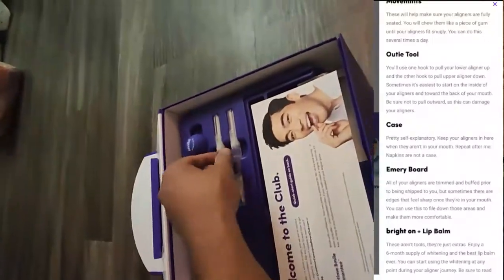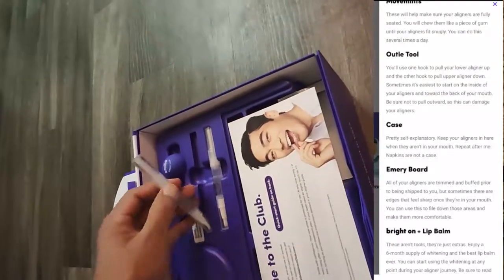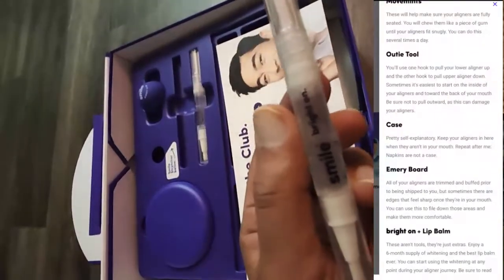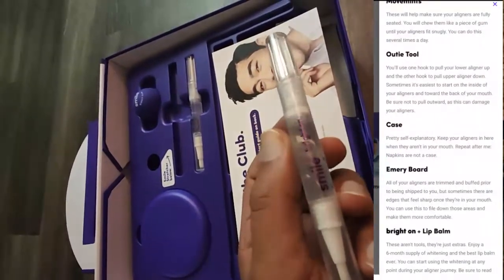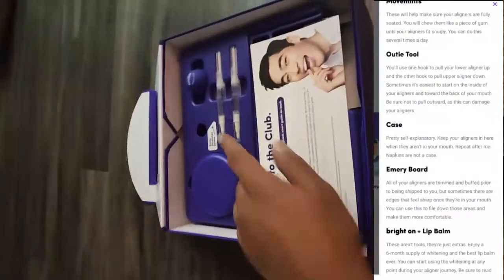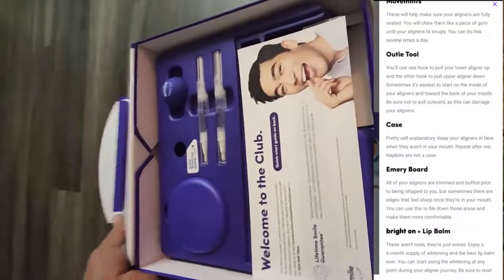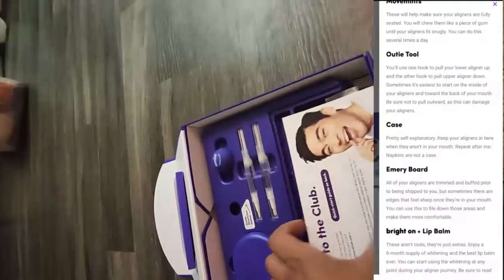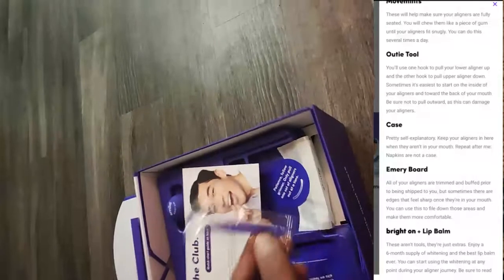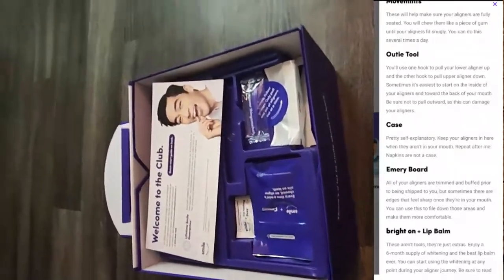You typically have to wear the clear aligners for 22 hours every day. The first aligner I wear for one week. There's also a Brighton whitening pen included. I've downloaded the SmileDirectClub app to track progress. To summarize: the Brighton pen, lip balm, aligner storage case, instruction manual envelope, movemints, Outie tool, cleaning tablets, and 15 sets of aligners.